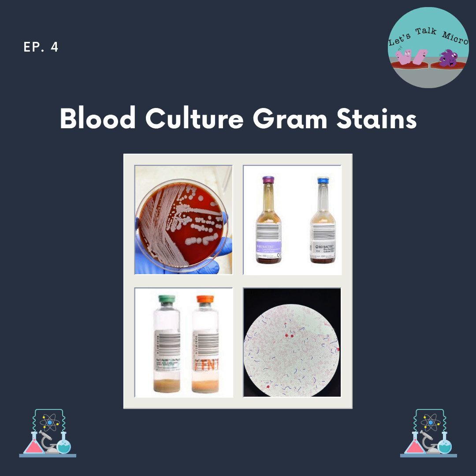So the companies supply the bottles, they supply the instruments. And once you collect these bottles, you place them in that instrument and you incubate them. I mentioned before, on the media episode, that you incubate your plates in a CO2 environment, carbon dioxide. So with these blood cultures, you actually incubate them in a non-CO2 environment. These instruments do not provide CO2. And then the length of incubation varies with the organisms.